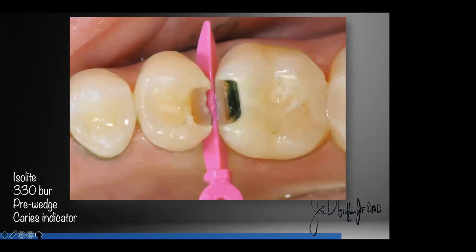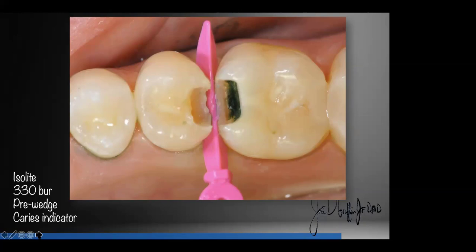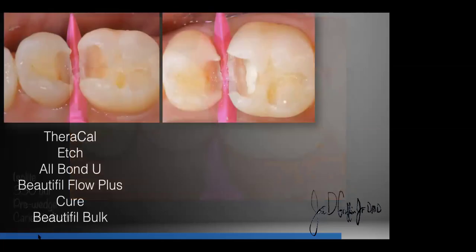Concept number two — what is the bond strength to decay? Can you bond to decay? Can you leave decay? A lot of us leave decay inadvertently, and some of us will leave certain decay in certain positions in the tooth. In this case, we're going to use Caries Indicator. We put it on the tooth, rinse it off, and then it shows me where I missed. Not all decay is colored dark, and a lot of us rely just on vision to determine if there's decay. Some of you use an explorer to poke things. But I'm better when I have help — I use Caries Indicator to see where I missed decay.